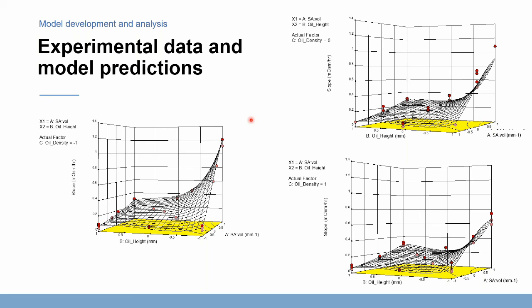Okay, can you hear me? Yep, I can. Well, functional data analysis is about the whole idea that the response is not a point, it's a function. And you can actually build into the modeling part parameters like a slope, for example, but you actually are modeling not just a point, you're modeling the whole thing. So slopes and quadratics and even exponentials and other things can get taken into account. Some of the approaches use spline fitting and other things to do that, but it's excellent for predicting in situations like you're describing.